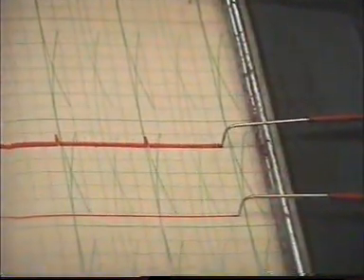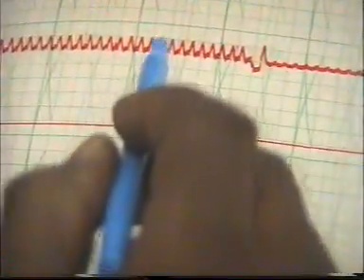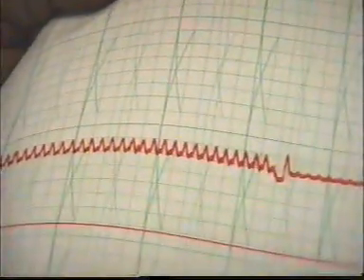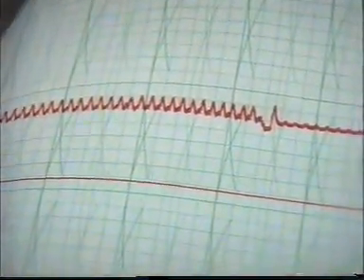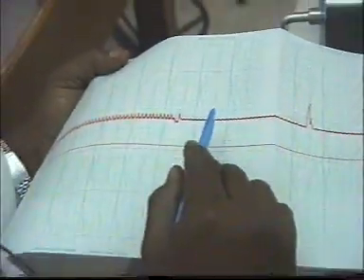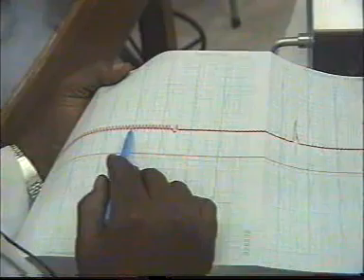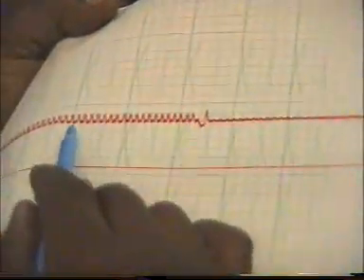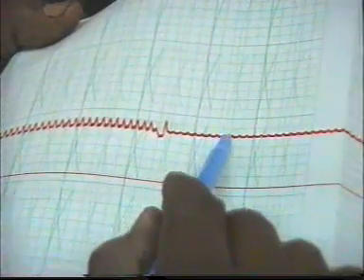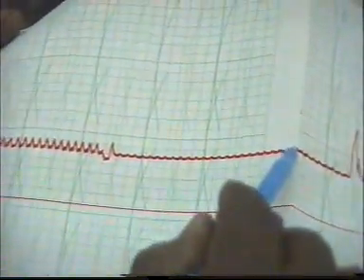This record demonstrates the application of Stannius ligature, which shows the block of the transmission of excitation from the sinus venosus to the auricle and ventricle. When we tie the first ligature, this is the normal heartbeat. When we tie the first ligature, we get only the beating of the sinus venosus, like that.